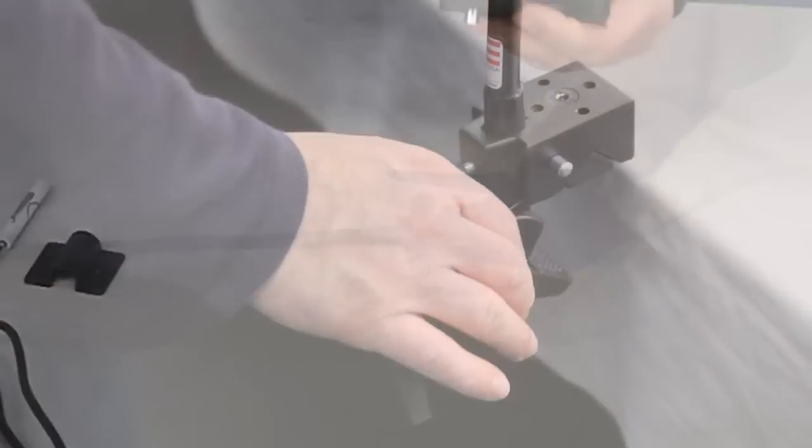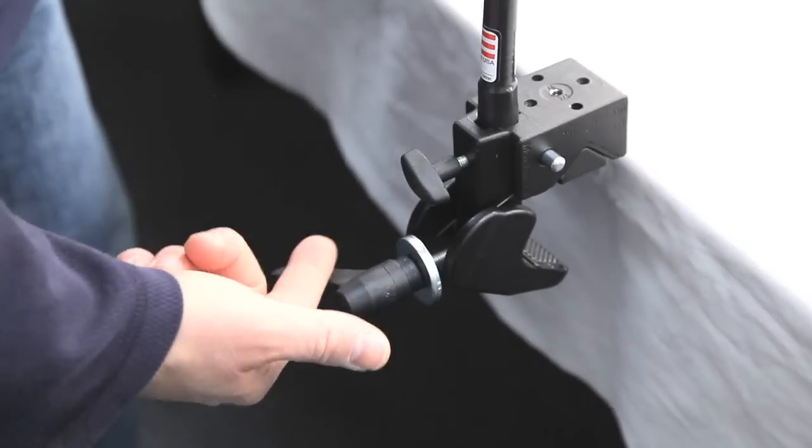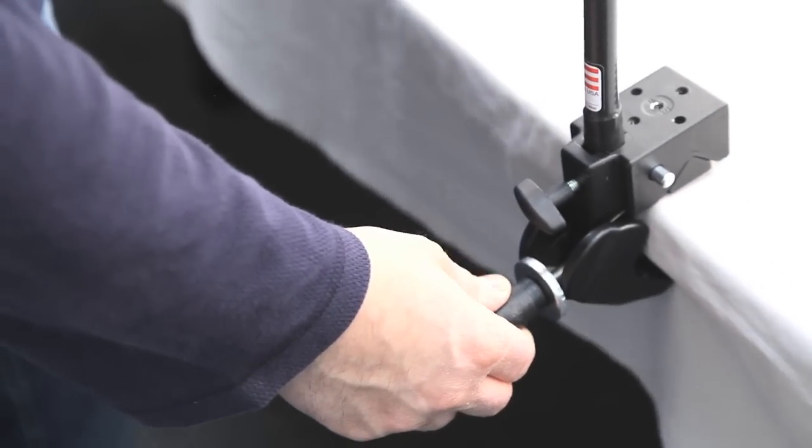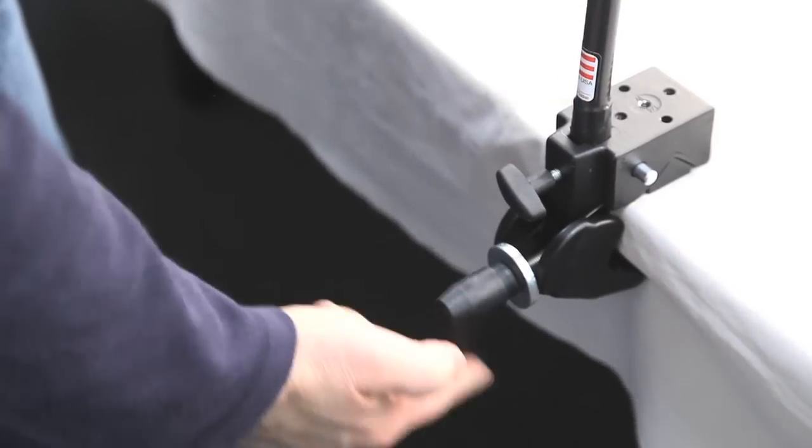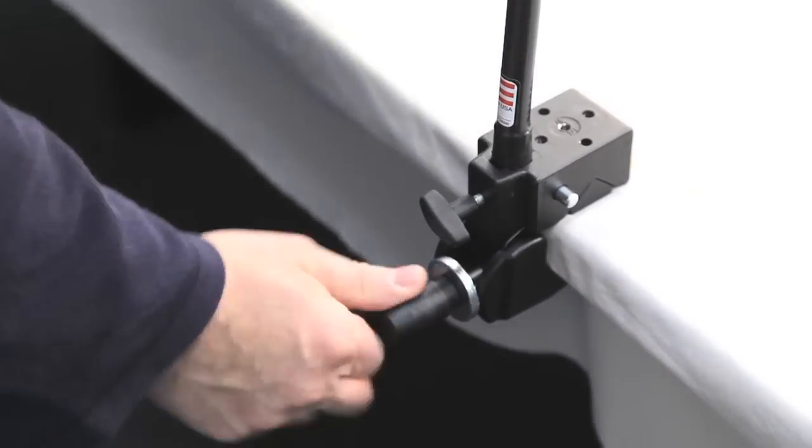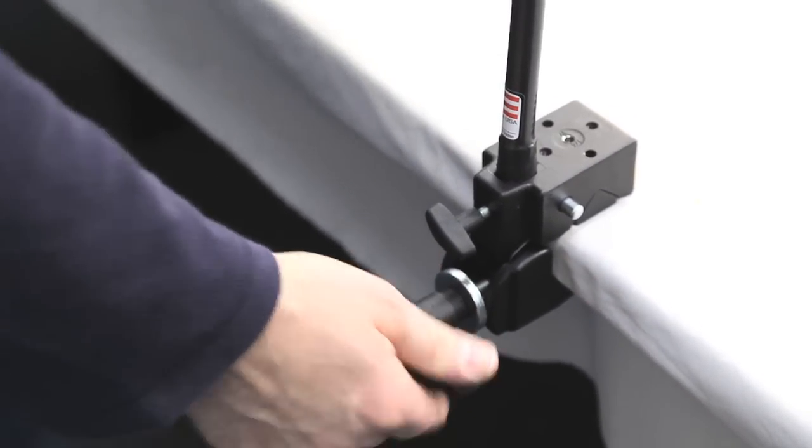So what you would do is, if you're going to be mounting this to a table, you just open the jaw up by backing off the set knob until the proper opening, then put it up against your table and tighten this up with your hand until it's secure. Now this is a very secure mount.